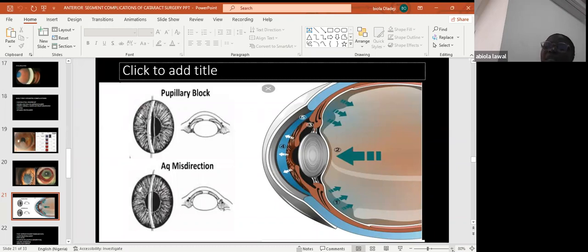One way to disrupt this process is to perform a YAG capsulotomy and alter the anterior vitreous face. When there's disruption of the anterior vitreous face, this allows the fluid to flow back. If this does not help, Chandler's procedure can be done, which is aspiration of vitreous out through a sclerotomy port, or a pars plana vitrectomy can be done ultimately to relieve this.